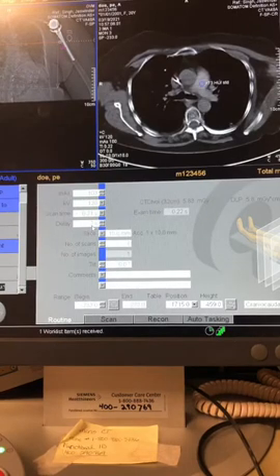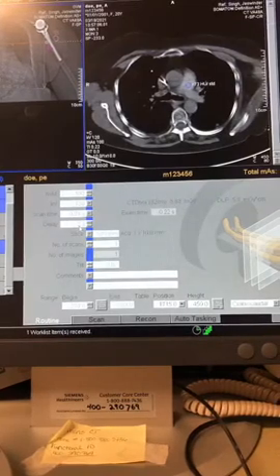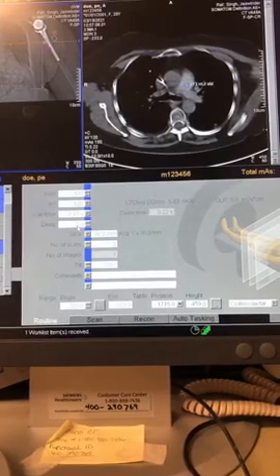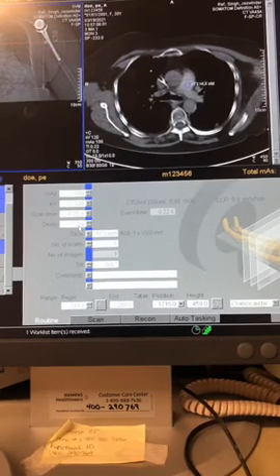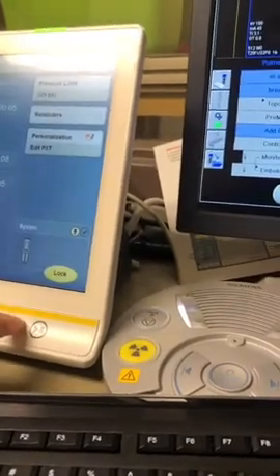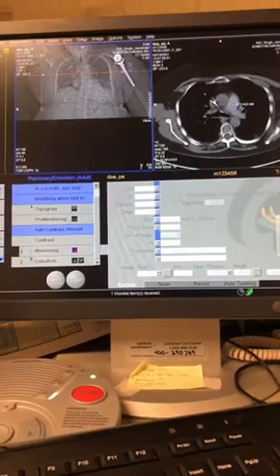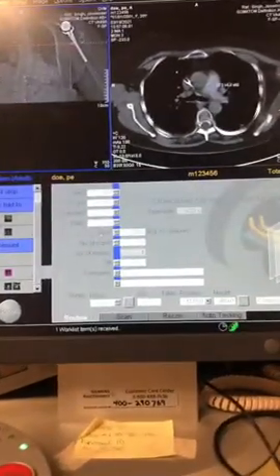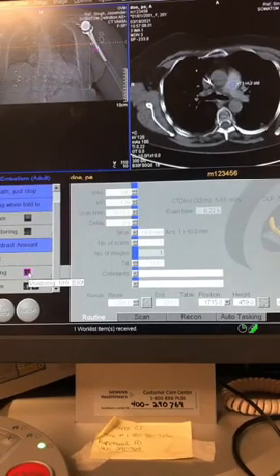All right, so essentially, I'm gonna set all this up, get my ROI in, give a saline flush on my power injector, and then say, okay, here comes contrast. I'm gonna hit both of these buttons here. Let me show you. I'm gonna hit this button, which starts my injection, and this button, which starts my scan. Then the scanner is only gonna count down 2 seconds, which is the minimum it can count down to be prepared. So it's gonna go really fast, all right?